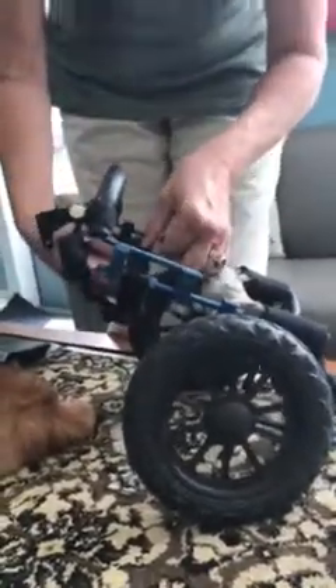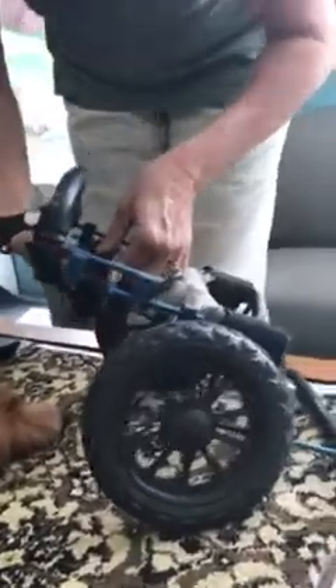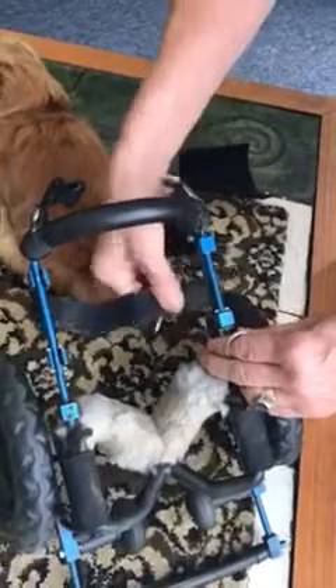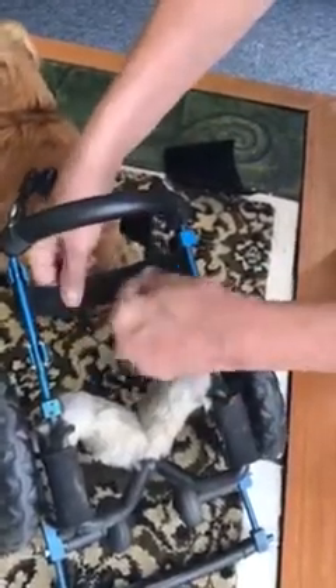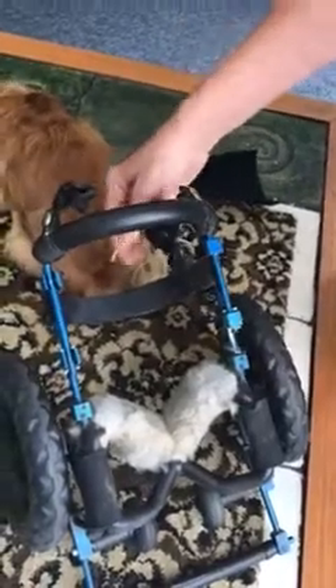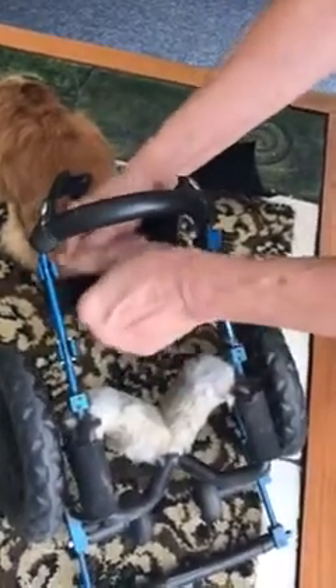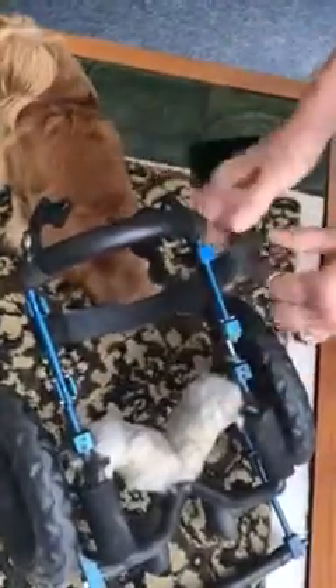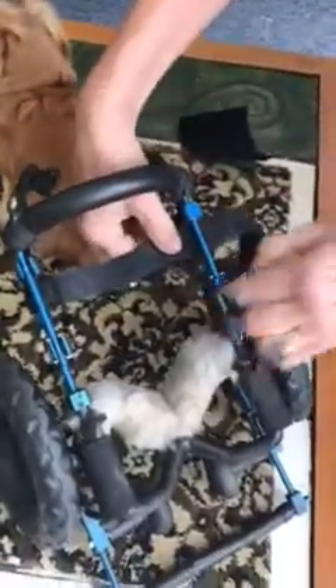The first time you put the dog in the cart, you need to take the cover off and remove the little velcro lock that keeps the support strap from sliding back into an inappropriate spot. This support strap should be as close to the dog's armpit as is comfortable, then release all the velcro on it so that it's not attached to the other side.